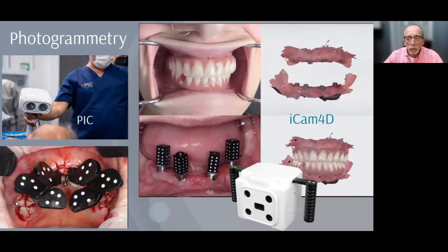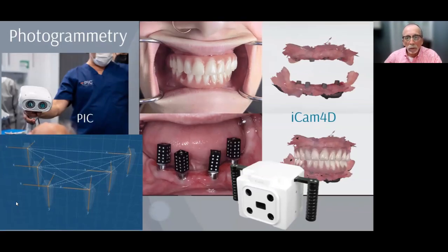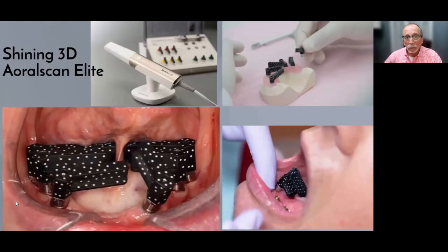So this is a method that allows us to really capture position and placement well, so that we can reduce the delivery time or the conversion time, because the data is so accurate that when we make something with this data added to our design, then we have good success. So it's a lot of engineering, a lot of technology. And the flip side of that coin is that it's typically relatively expensive.